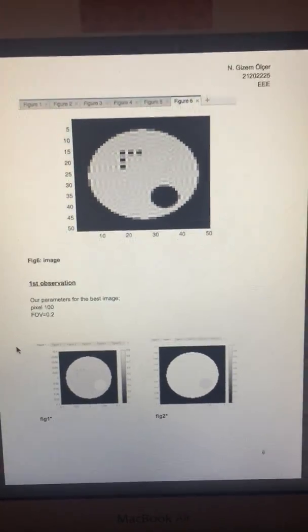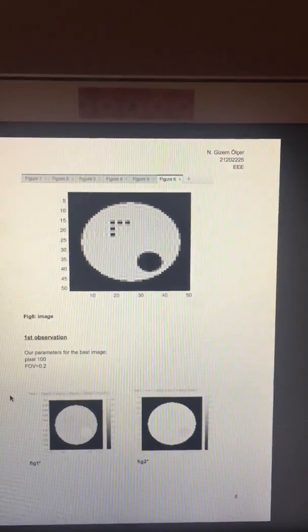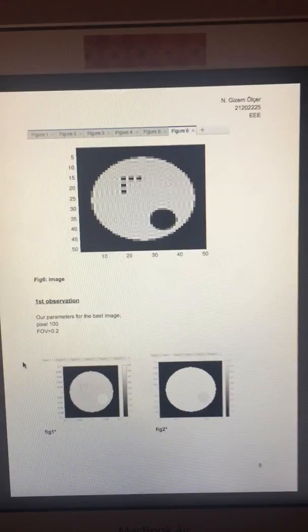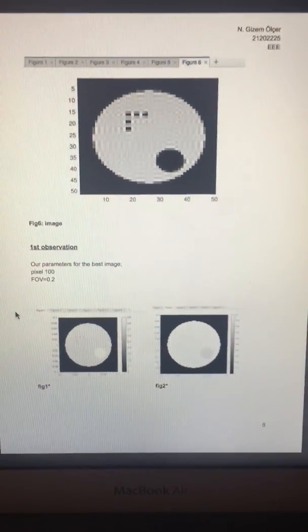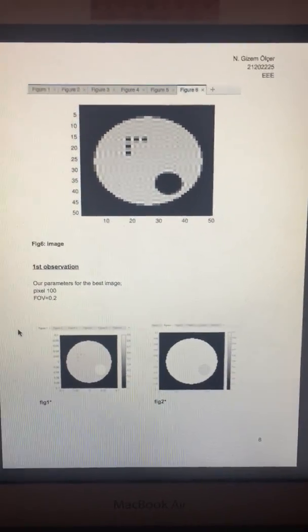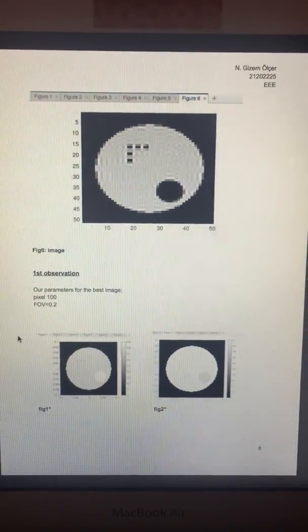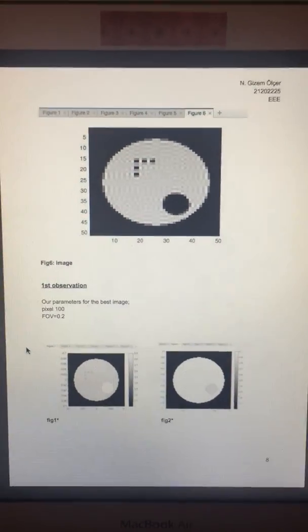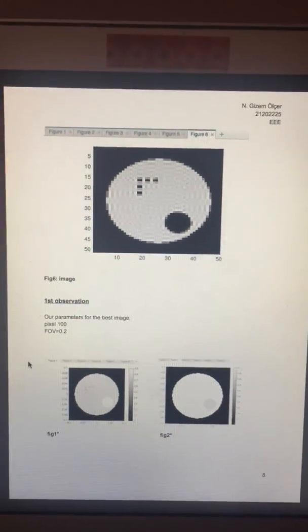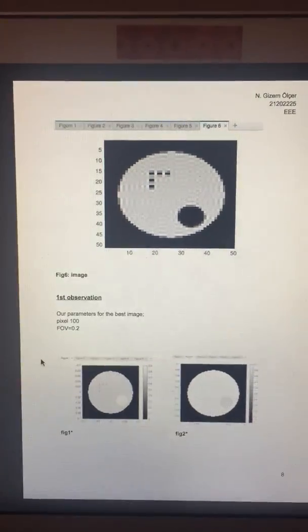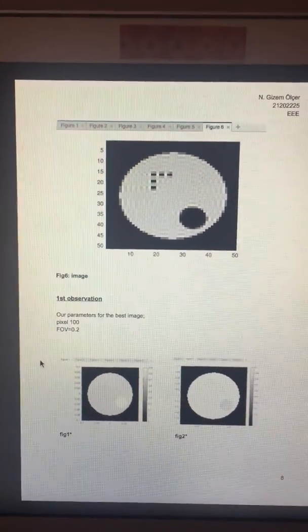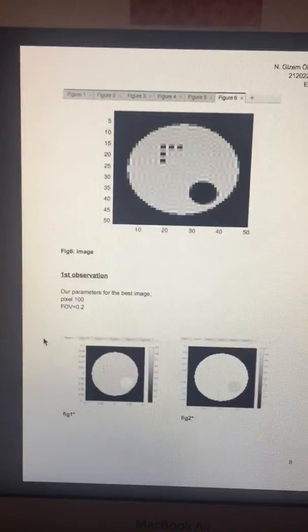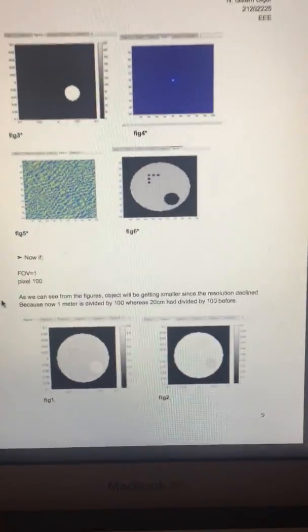Now I'm going to mention my observations. First observation is about field of view. We expect that when we decline the field of view, aliasing will occur. And when we increment field of view, the object will be getting smaller, as you can see.